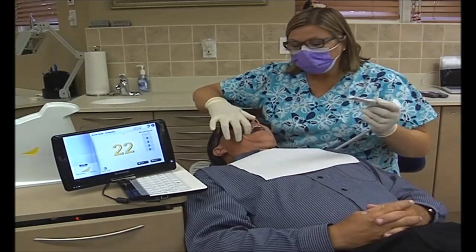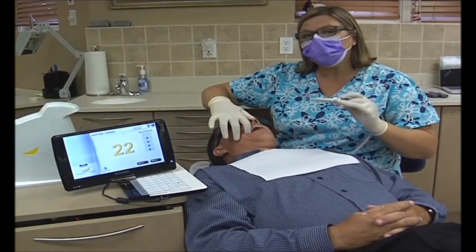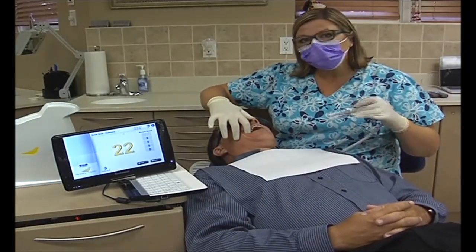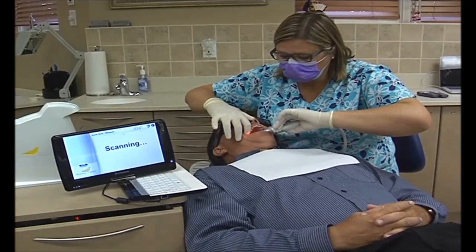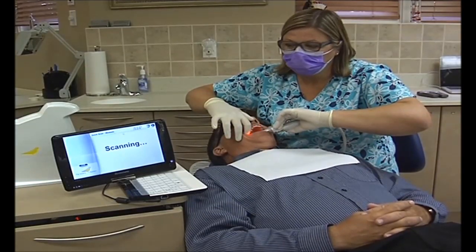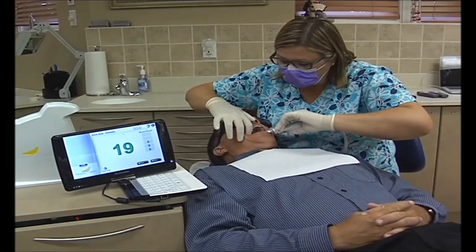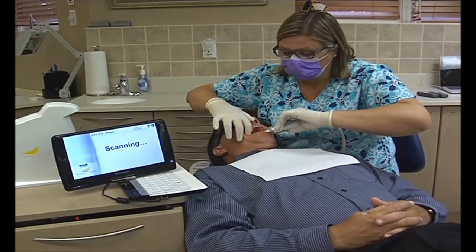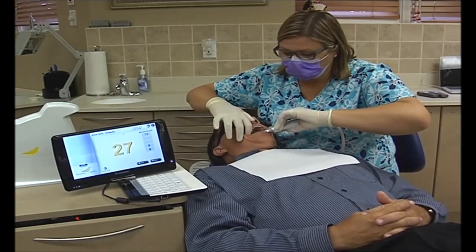22. So we know we're still in around that healthy mark — 20 and under is a very healthy tooth, so there's just starting to get some breakdown. At this point on that tooth I wouldn't do anything, but I'm going to check around the whole restoration, not just one spot. This is how easy it actually is — you just scan around an old restoration. Very healthy. And when I'm scanning, I'm pointing the laser onto the tooth structure, not the amalgam.